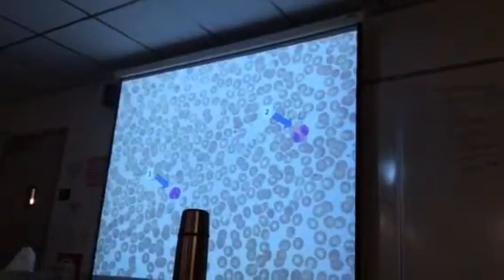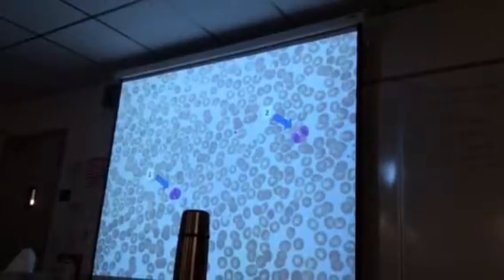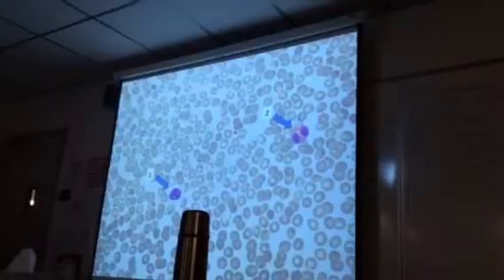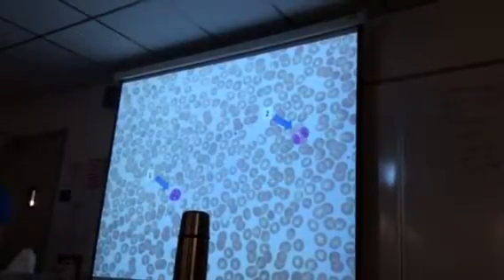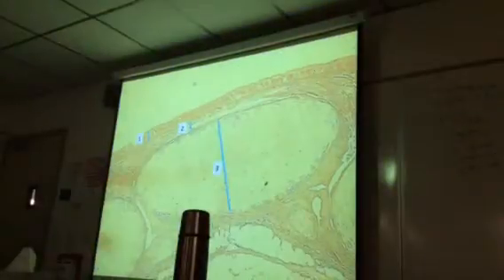Okay, number 1, lymphocyte. Lymphocytes look like monocytes, except monocytes have that kidney-shaped nucleus. Number 2, 2-lobe, red granules. Again, it's an eosinophil. So I'm going to move away from blood, and now we're going to get into respiratory.